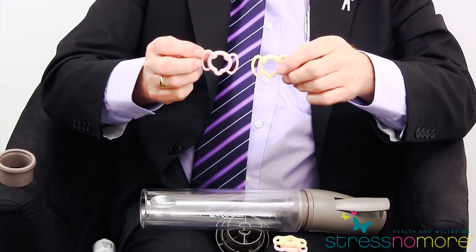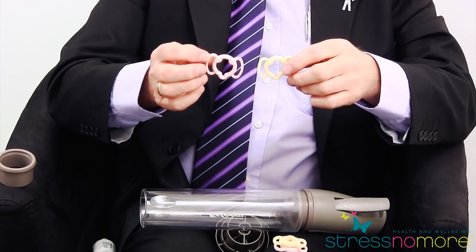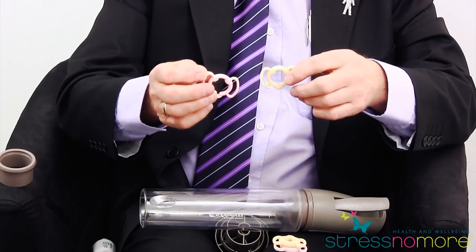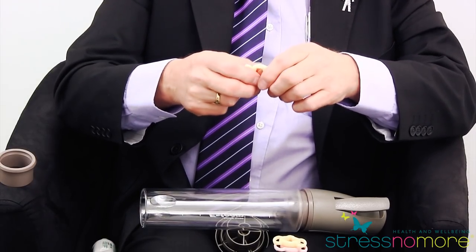The difference is, as you can see, there's a pink and a beige material. The beige material stretches more than its pink equivalent, or applies less pressure. Therefore, what you're looking for is to try the beige ring first, because the principle of maintaining an erection is not to choose the smallest ring and cut off and trap the blood in the penis, but to apply the least pressure that's necessary to maintain the erection.